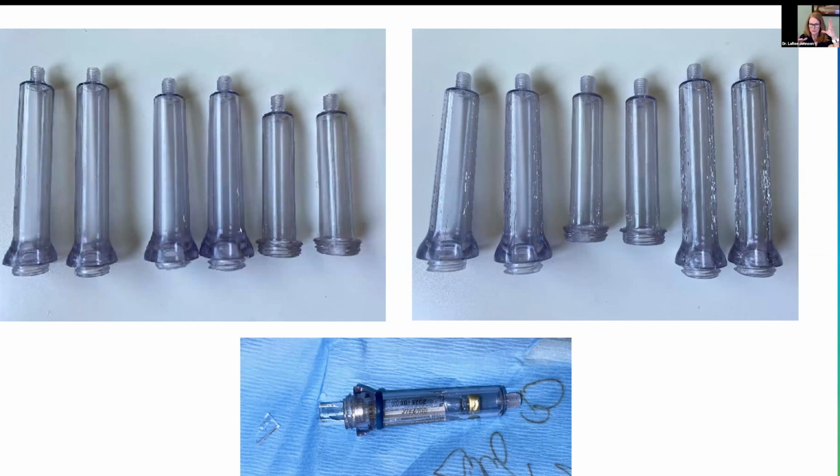And anesthetic solution filled the container. And then I quickly took it out because I was worried that the anesthetic solution being near the plunger could cause an issue with the device. The plunger is very sensitive in these devices. I cleaned it out. But yeah, that's what happens when you don't follow instructions and replace your containers. That happened Tuesday. So there you go.